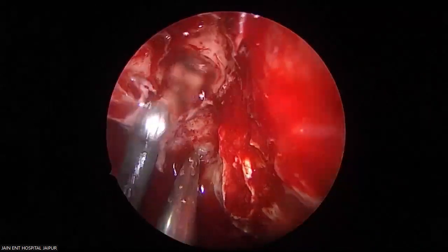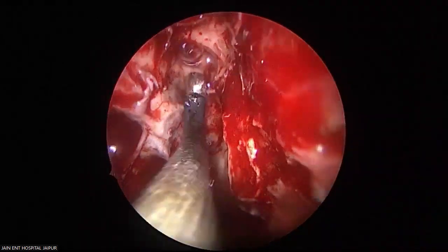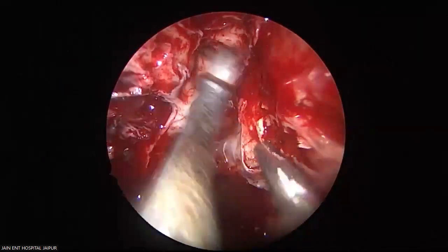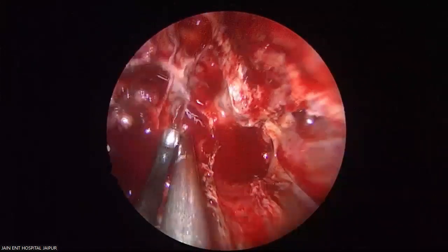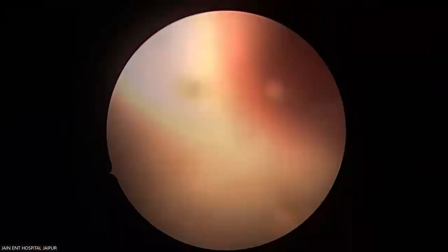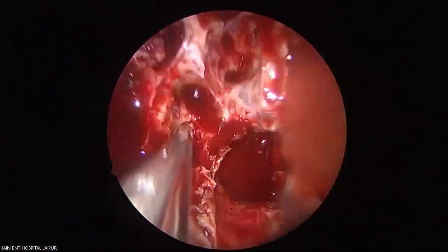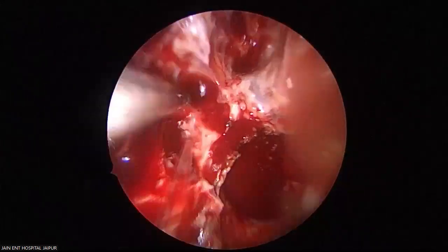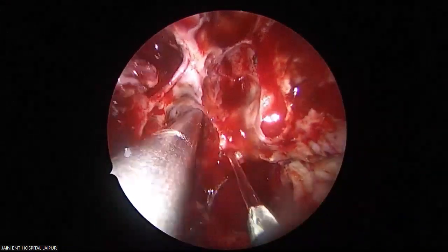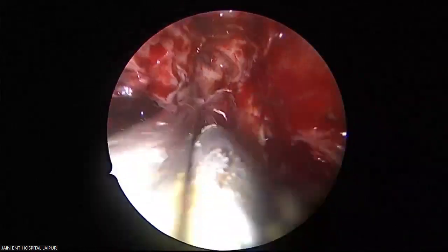See, they are up. This is the Onodi cell and the optic nerve above. Can you see above there? This is your sphenoid sinus. Now this is your pterygoid base. This is pterygoid base, absolutely clear. Pterygoid fossa. See the bone, completely, all the honeycomb bone of the sphenoid sinus drilled. That is Onodi above.